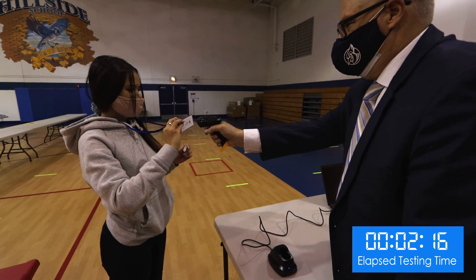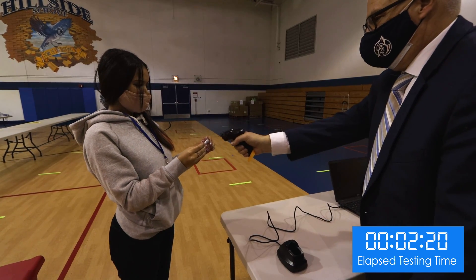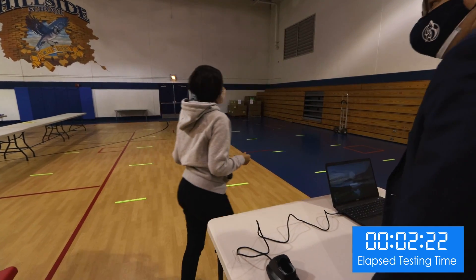At the checkout station, her QR code is scanned, followed by the label on her test tube, in order to associate the test tube with her.